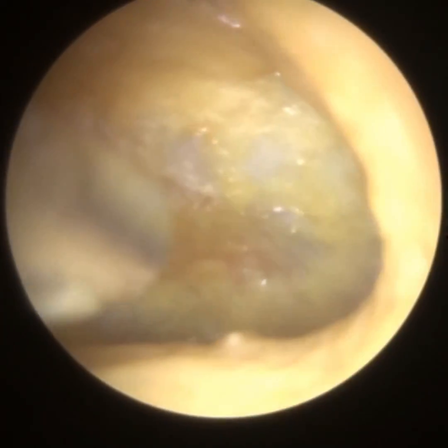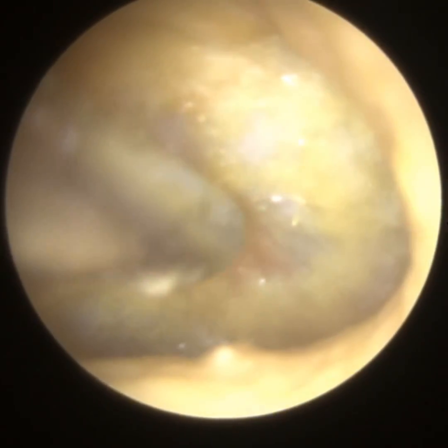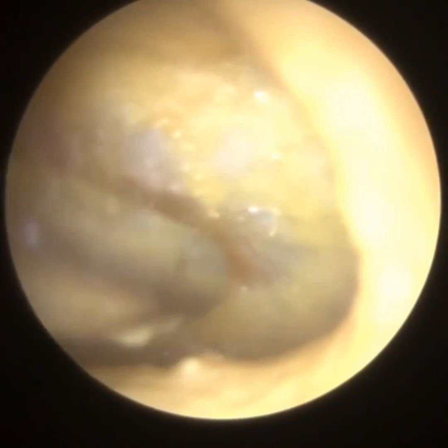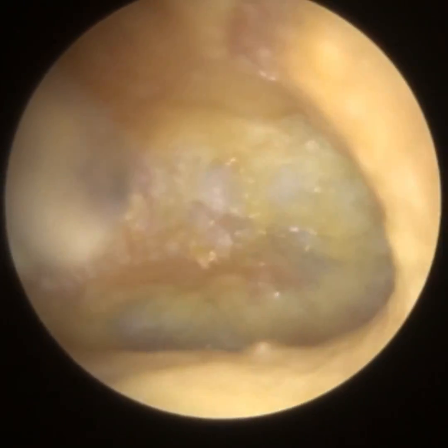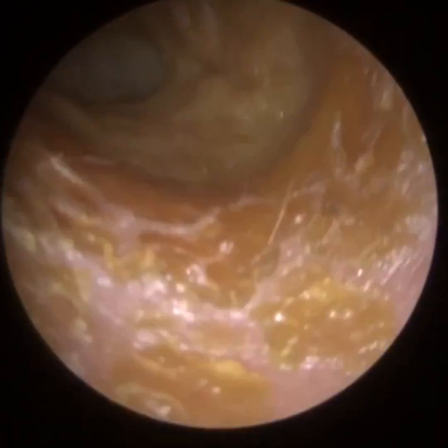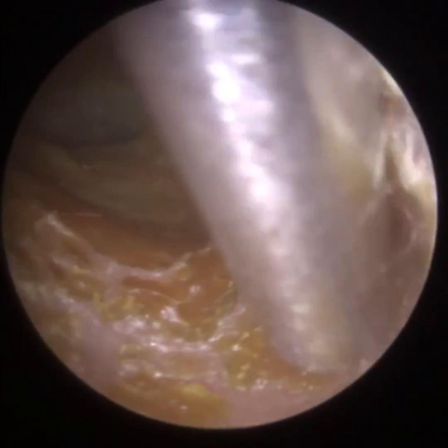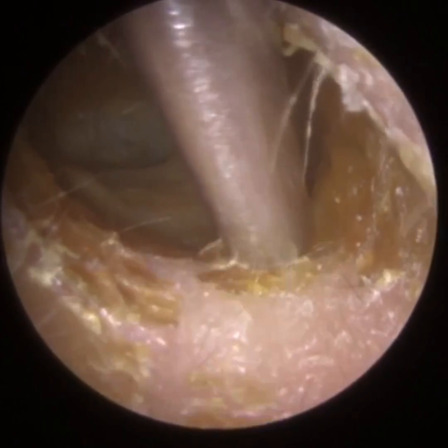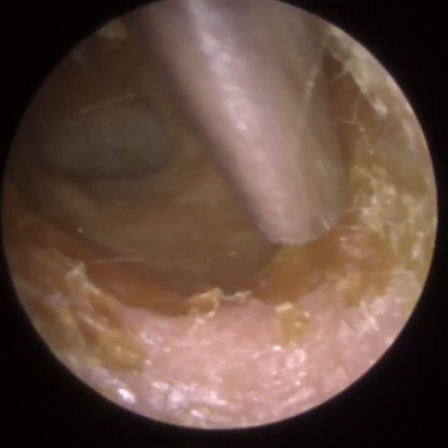And so that's what I was expecting, but when the patient attended, you can see the ear canal just looks like a normal ear canal in terms of anatomy. What they've got is all this dead skin, dried otorrhea. So otorrhea is like a discharge, pus, and it's kind of crystallized all over the ear canal. So the patient is suffering from otitis externa. Otitis externa is an infection and/or inflammation of the outer ear canal and the outermost layer of the eardrum.